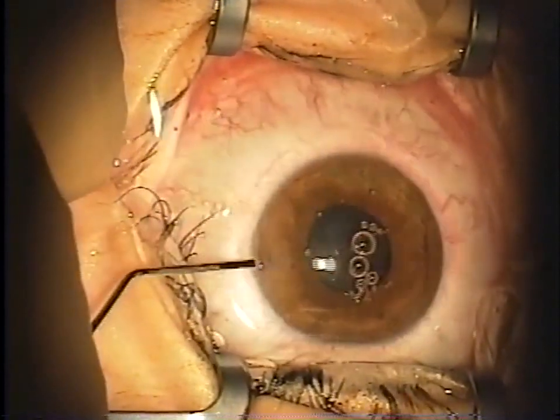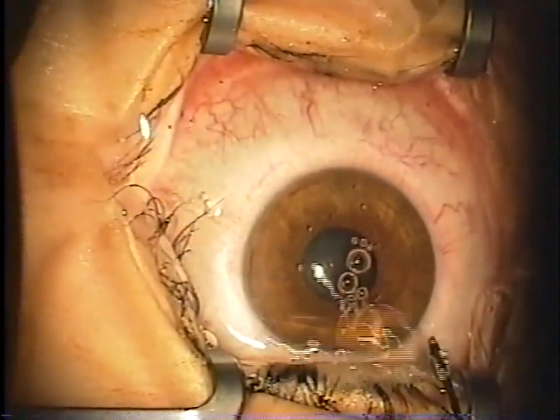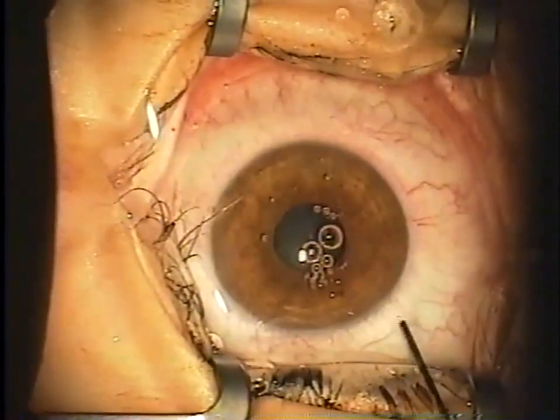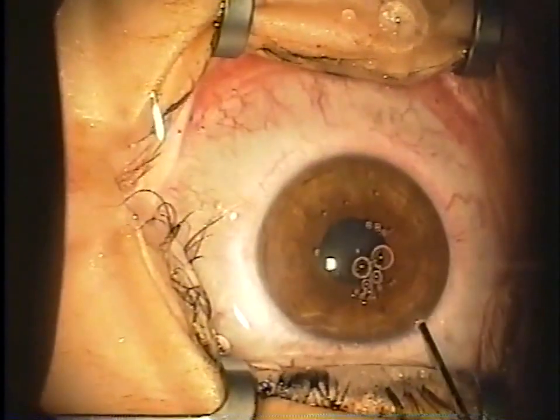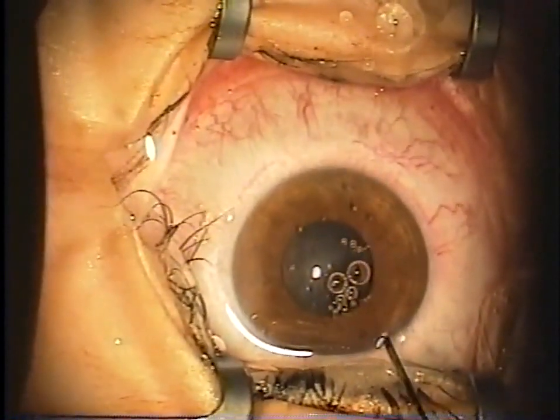Here you can see the pupil come down nicely once a little more of the OcuCoat was burped out and the Miostat had a chance to work on the pupil. And next, just a little bit of rinsing to make sure all the OcuCoat is completely removed and there's not going to be any early pressure spike.